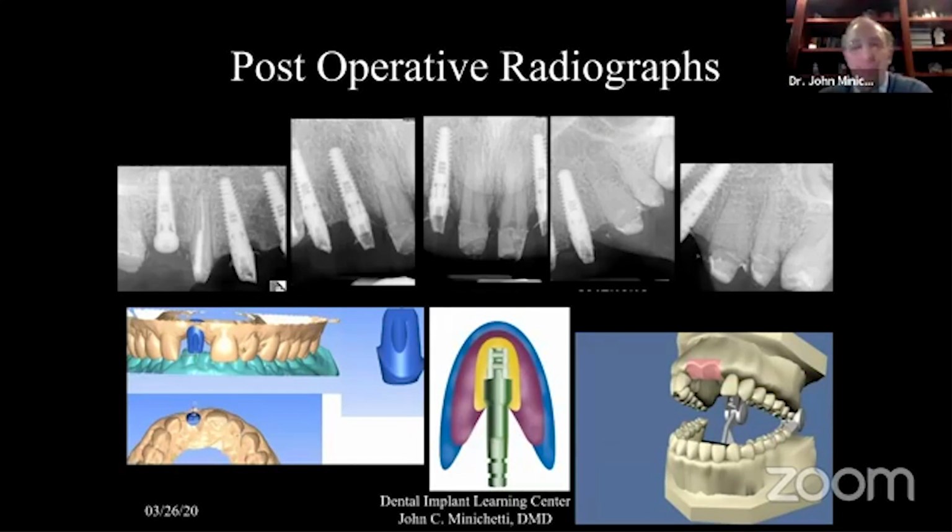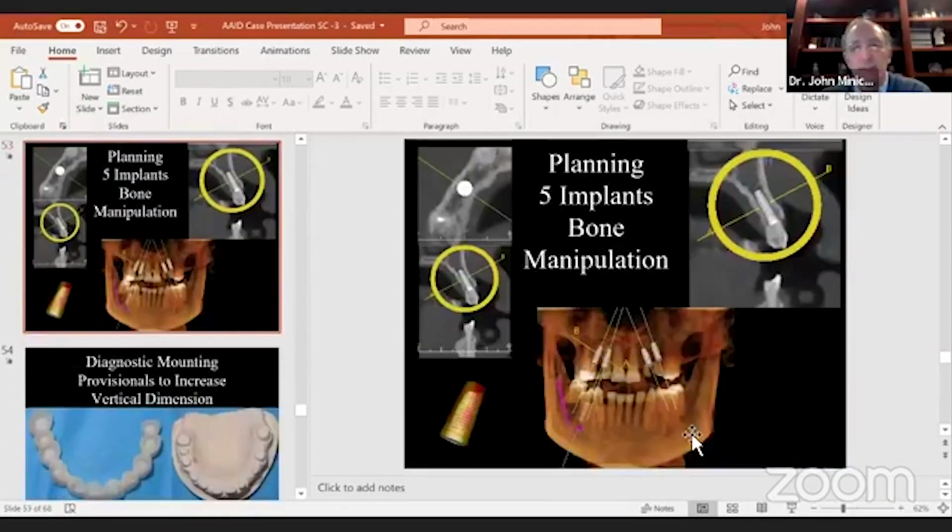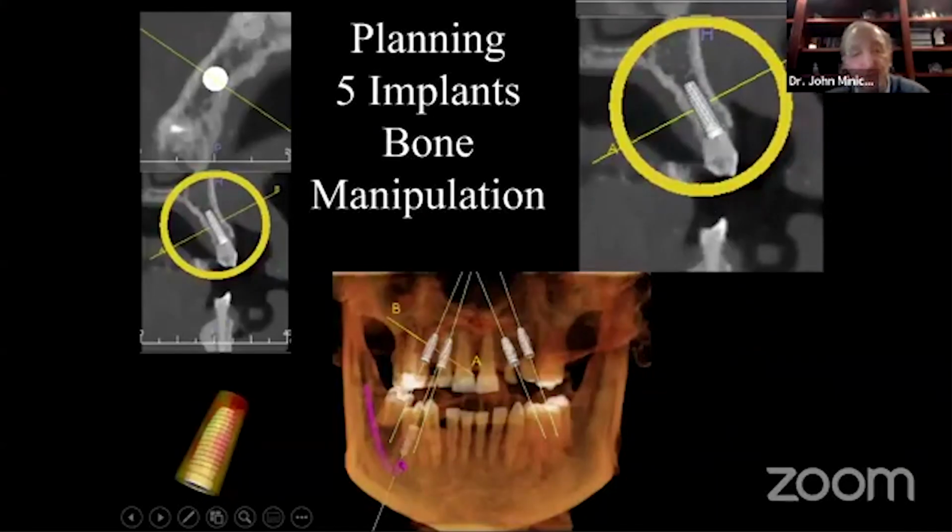Let's look at, I gotta click out of here. Somebody wants to see the CBCT again. I could show you the CBCT 3D image showing implant positioning in the proper prosthetic position, corresponding distal to tooth number 7. That's why I decided to extract it, and mesial to that primary number 6. This space on the upper right was much wider than the space on the upper left. So that's why I decided to extract number 7, just to make this more symmetrical.